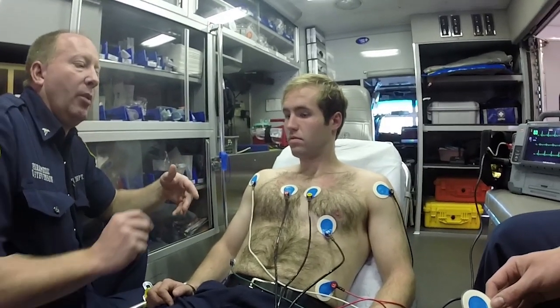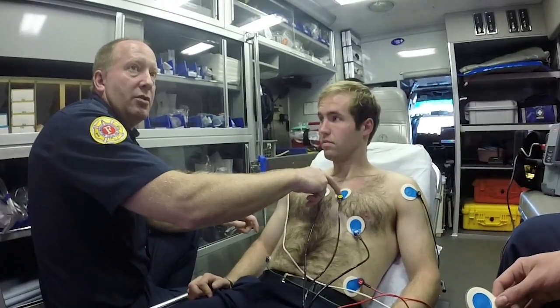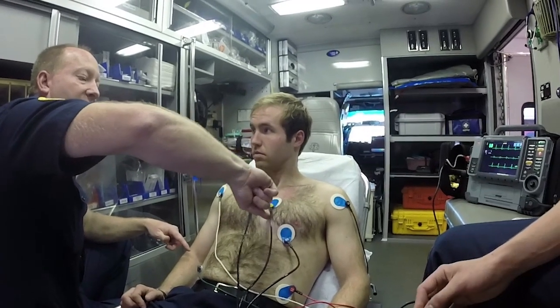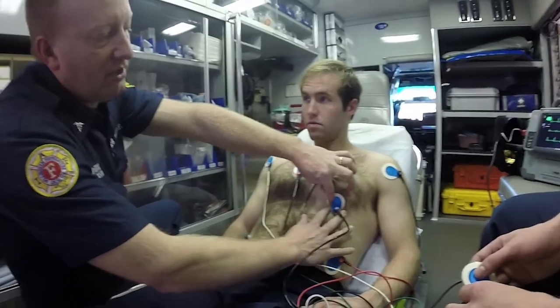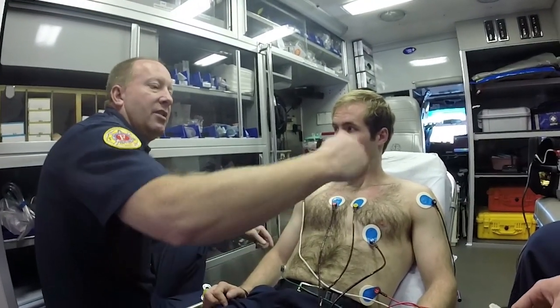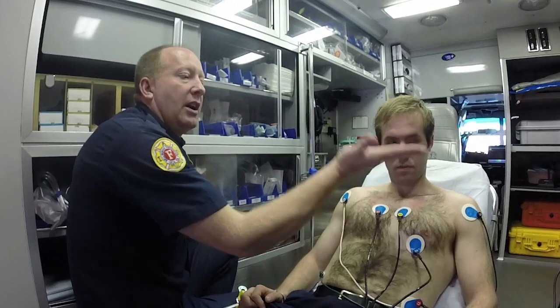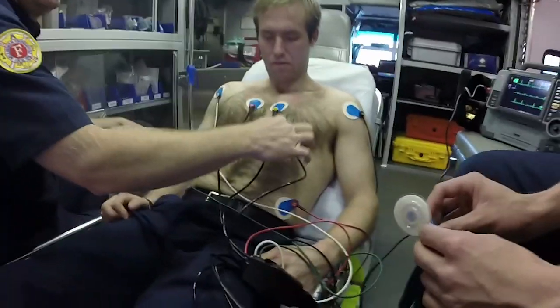They always redo our 12 leads anyway. V1 and V2 are usually pretty easy with a female — you're lifting up the shirt, showing a bra, and you can get to these two pretty easy. V3 is almost the worst — the bra starts to loop up, and you have to pull it away enough to get this one in. For V4, you can get under the edge of that bra, kind of lift the edge just a little bit, and put it right in the fold. You don't want it in a crease so much that the blue dot portion doesn't actually touch skin, so sometimes it's just a smidge below that fold. V3 just goes between two and four.